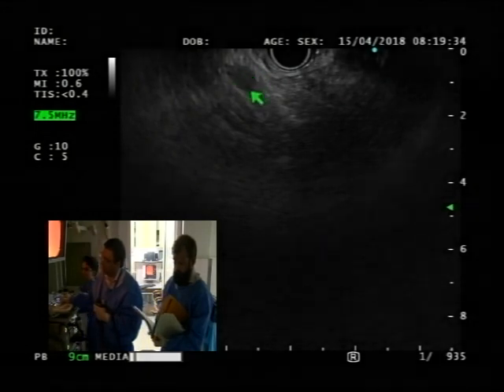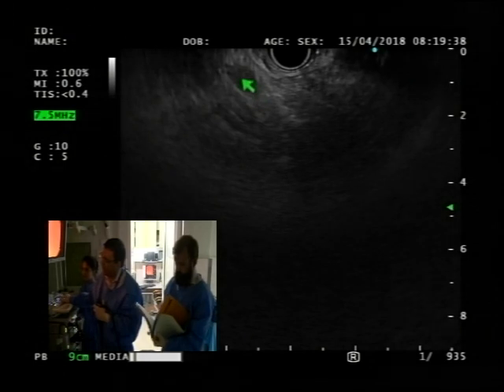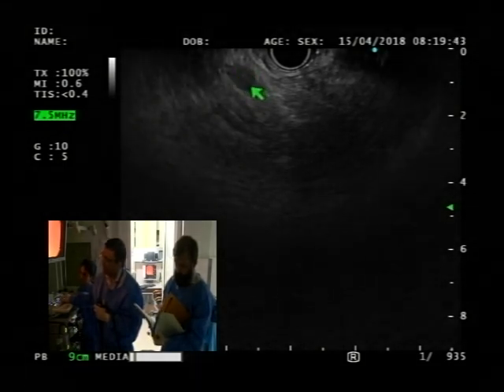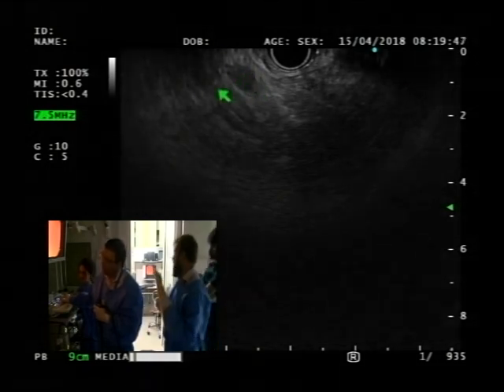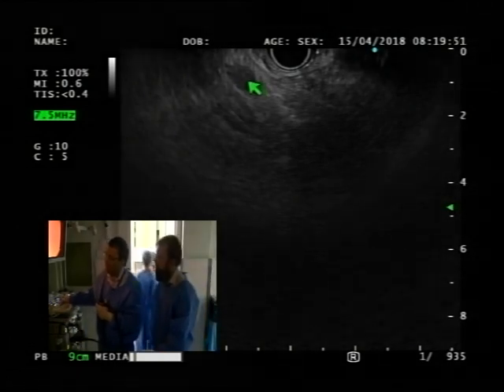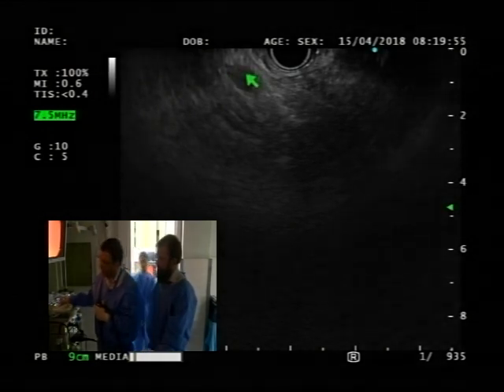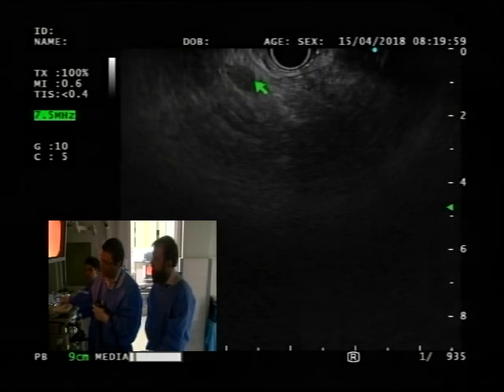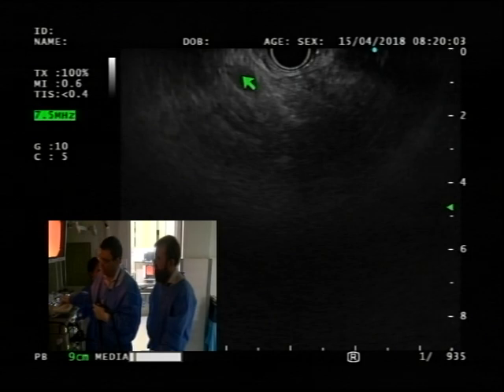And the tissue itself, you see white strands in there. I don't know how much it's projecting well. It's white and black, kind of a bit heterogeneous, certainly not hypoechoic, more towards isoechoic. The irregularity and oval shape, not well formed, not round, and isoechogenicity or heterogeneity, these are the features of a benign lymph node or inflammatory lymph nodes.